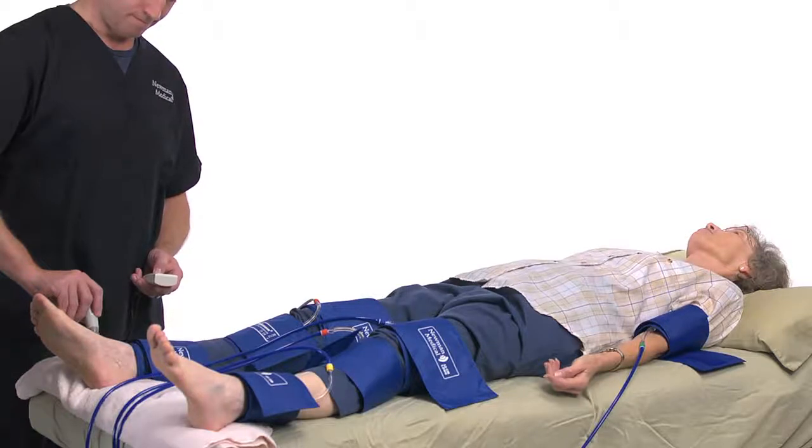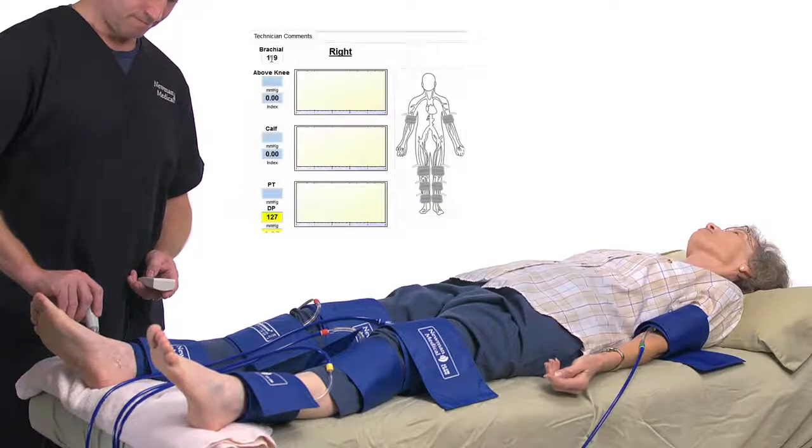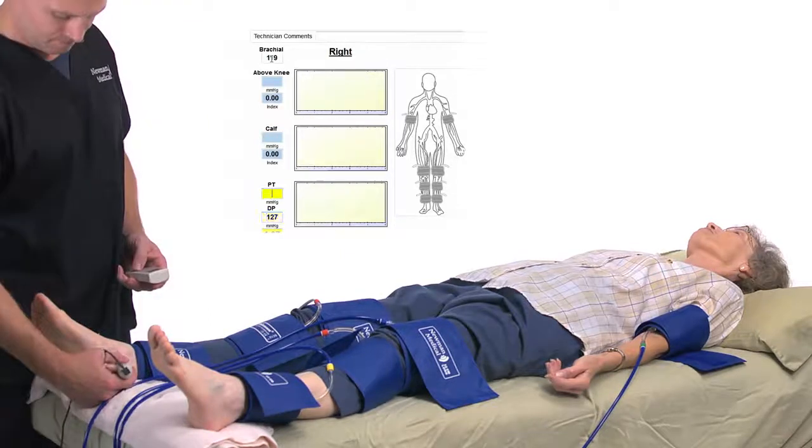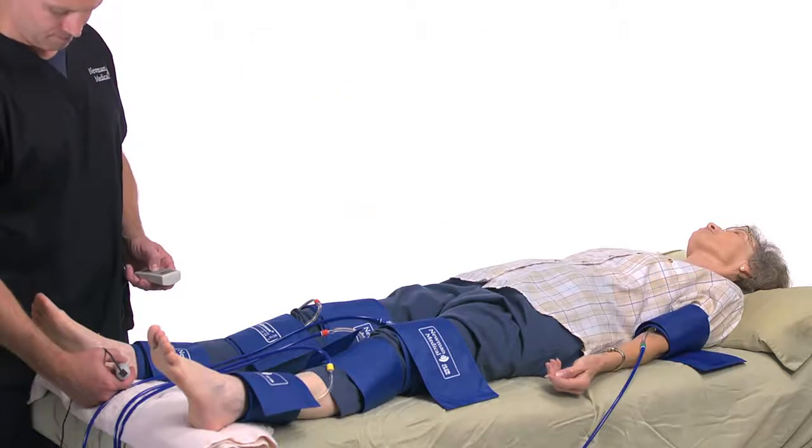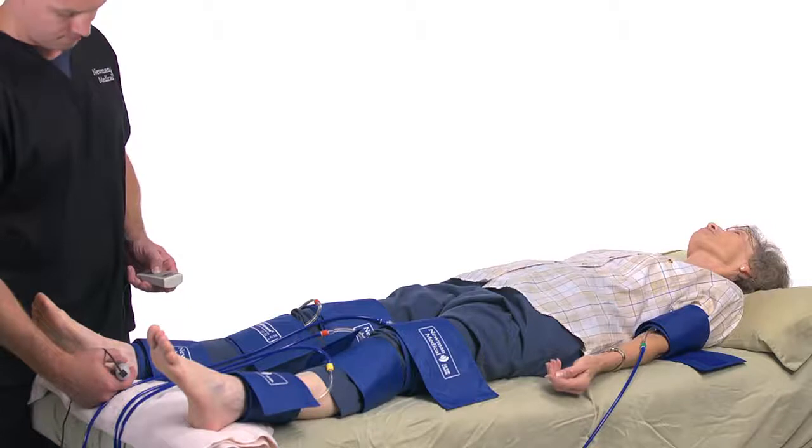Press and hold Inflate until blood flow is occluded, plus 20 mm. Release. And once blood flow is heard, press Pressure to enter the pressure in the DP field. Now press Next to move to the PT field. The PT artery is found roughly 1/2 inch below and behind the inside ankle bone. Obtain the pressure in a similar method as the other sites.